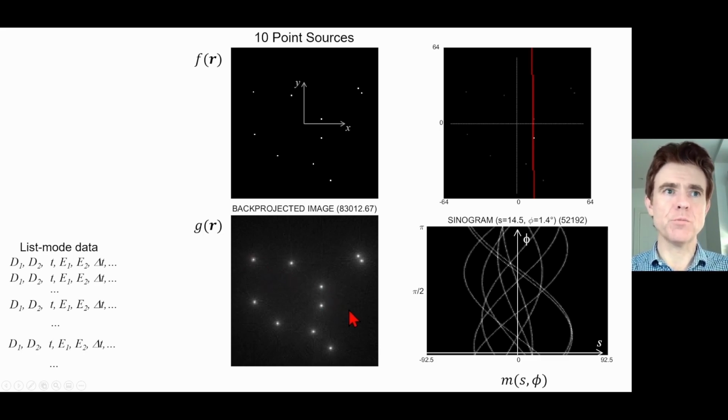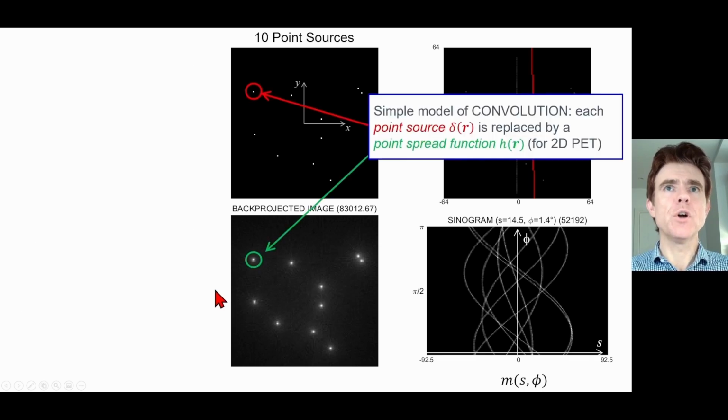I use that term quite loosely. Many people would call it a point spread function, some point response function. It's basically some function that we can see is different to the original sharp point that was in the true object. We've got some kind of distribution, some kind of spread function. So often called a PSF or point spread function. Okay, let's now begin to build up then the picture of convolution, which is a very useful concept in many fields of image processing.